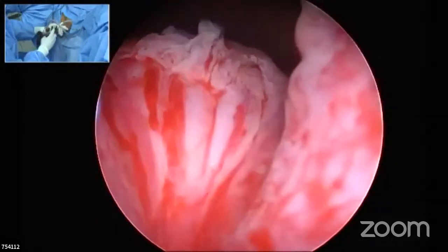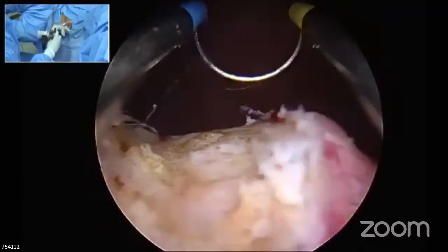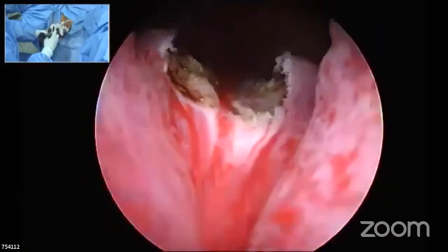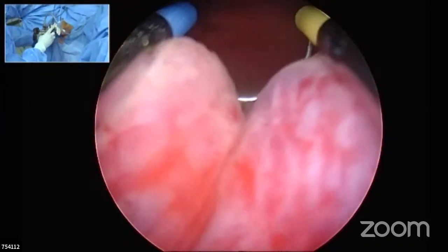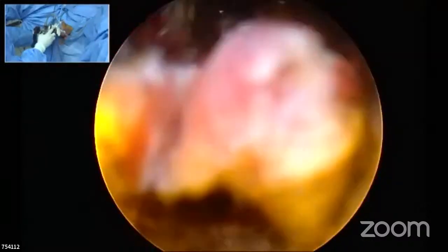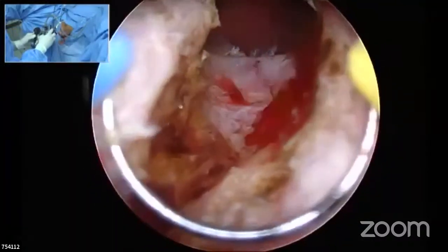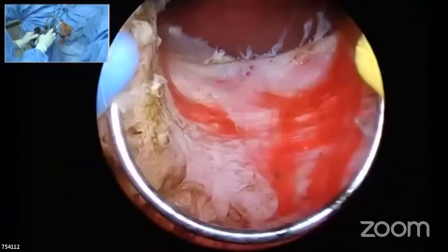Second thing is, I was telling about two ways of doing resection of the median lobe. One is directly going ahead and cutting the lobe. The other one is controlling the bleeder. So go to the portion where the bleeder comes on either side. Control the bleeder. One minute. Let me focus.